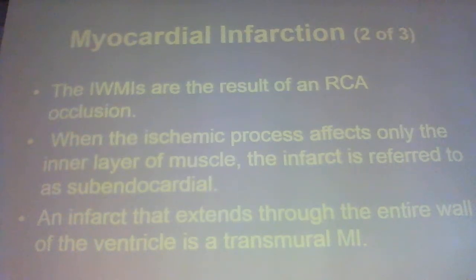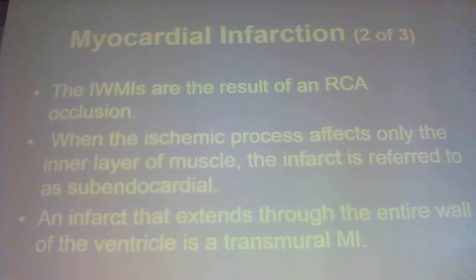That's my left ventricle. Impulses start in the endocardium and work their way out to the electrode, right? Okay. The muscle causes the electricity to slow down as it's going through there, right? That's what gives you the height of your QRS.